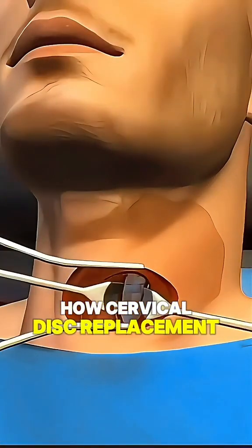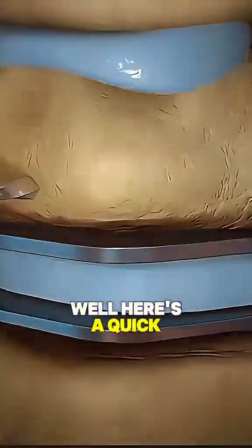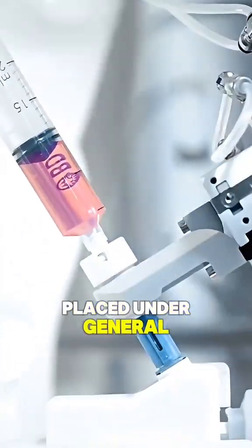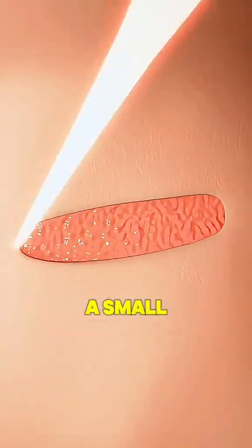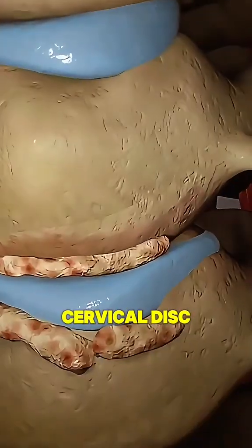Have you ever wondered how cervical disc replacement surgery is performed? Here's a quick breakdown. The surgery begins with the patient being placed under general anesthesia, ensuring they are fully asleep and pain-free. The surgeon then makes a small incision in the front of the neck to access the affected cervical disc.